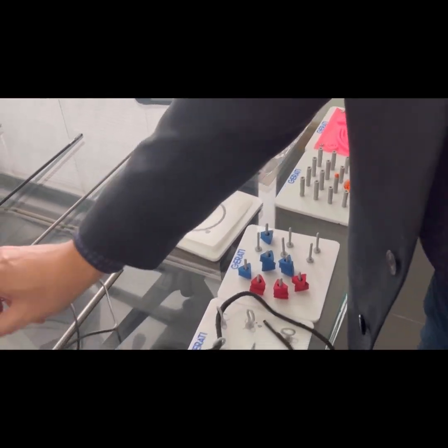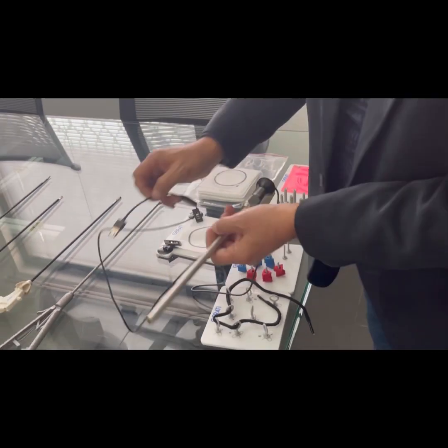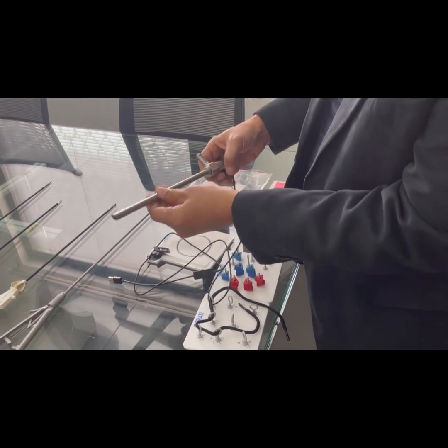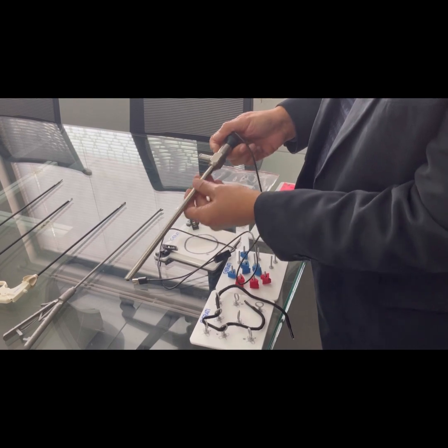We also have a USB camera — one of the different types we offer. It is a USB camera with light control, 10 millimeters in diameter and 30 centimeters in length.